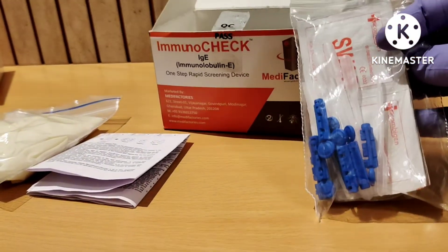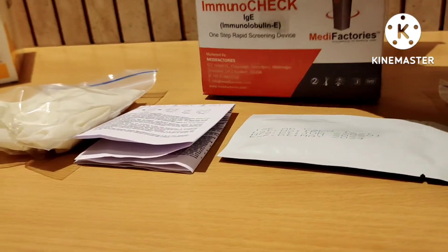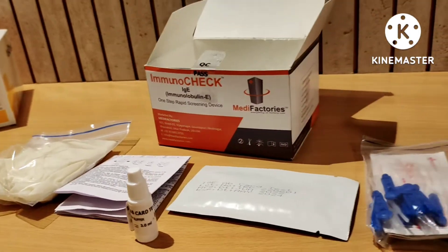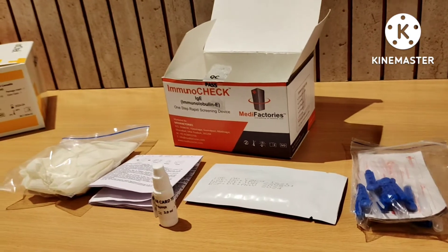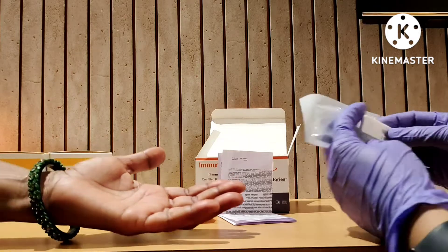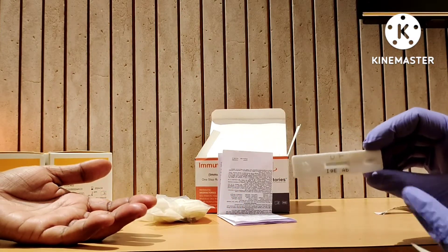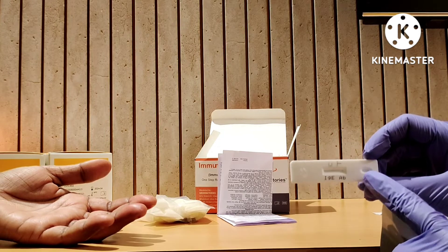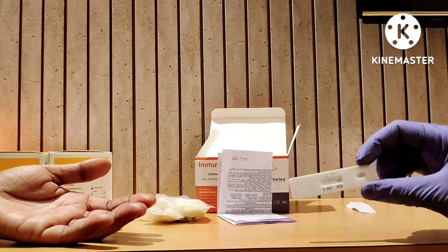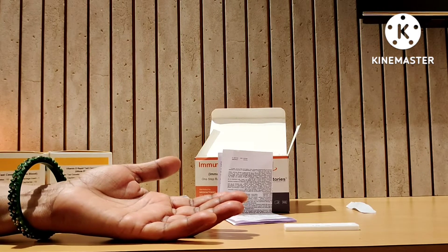Also included are an alcohol swab, dropper, lancet, test cards, and the buffer. Let's start the procedure now. Just open the card — here is the test strip for IgE. You can see this is the sample hole where we have to put the sample and buffer, and here you will get the band. Just keep it on a plain surface.